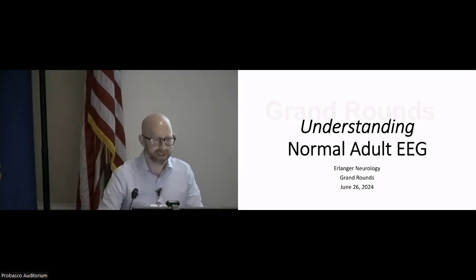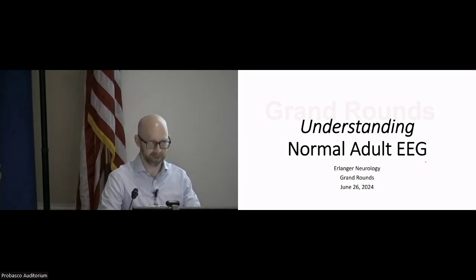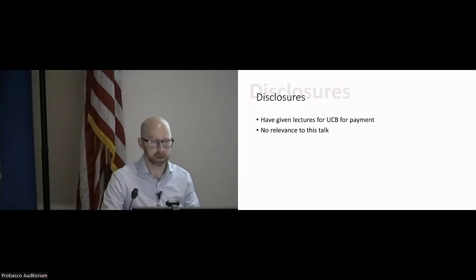So we'll start. We can't cover everything in one lecture, so it's really going to be normal awake and asleep EEG. We're going to go over the technical aspects a little bit. Probably the actual techs are coming, and probably this will seem very basic to them.